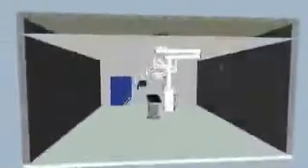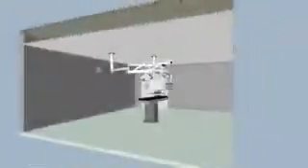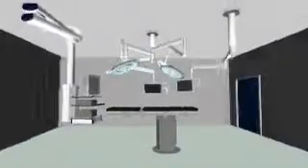The OR matrix is therefore the key component for operating theatres which are fitted with ceiling-fitted satellite swivel arms and optimized for good user ergonomics with monitors individually assigned to the operator and assistant. The functional range is rounded off by the implemented streaming function to carry out tele-teaching and teleconsulting. For the training of students, operations can be transmitted live to connected auditoriums, for instance.